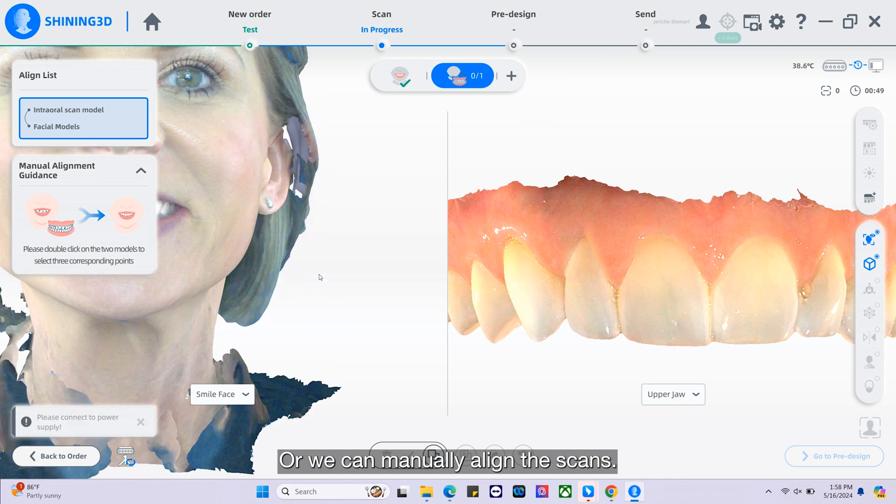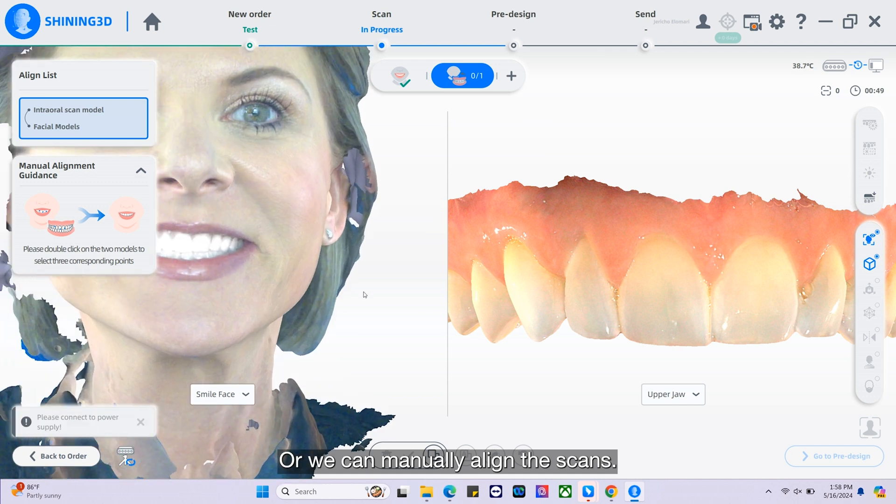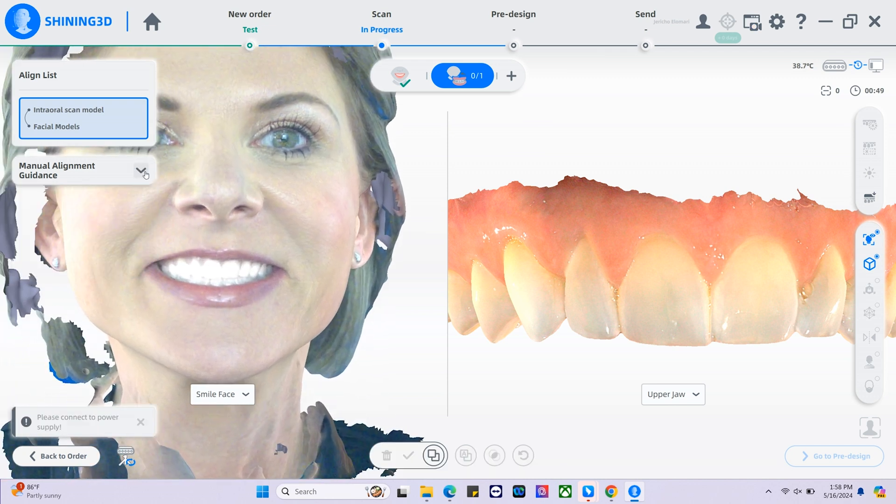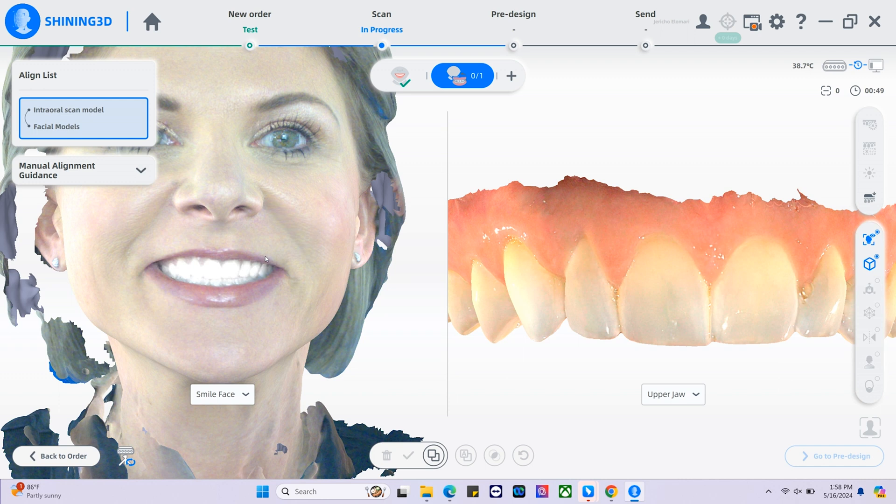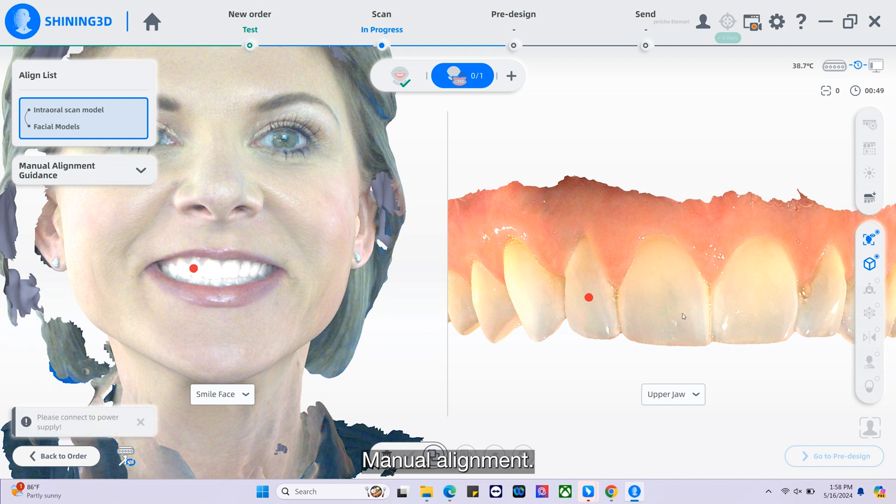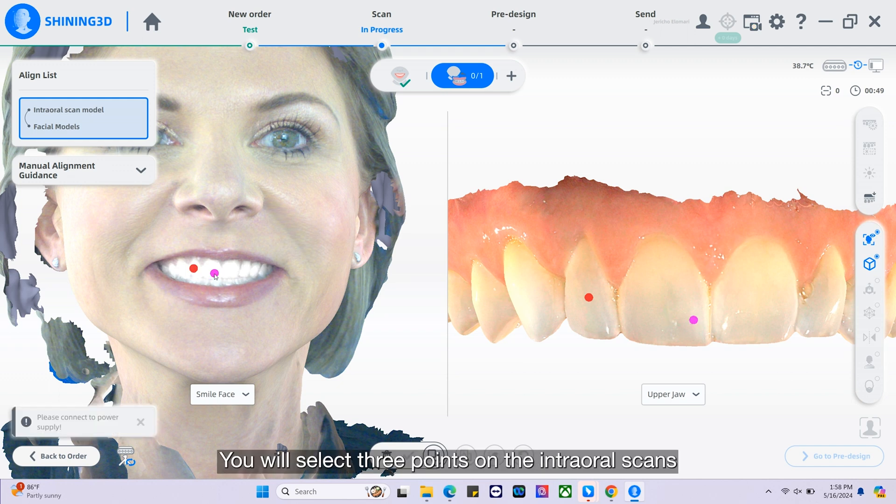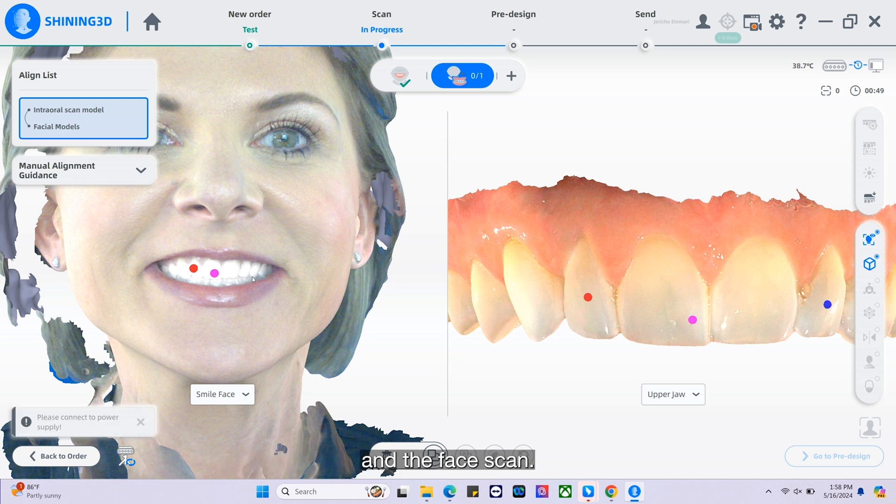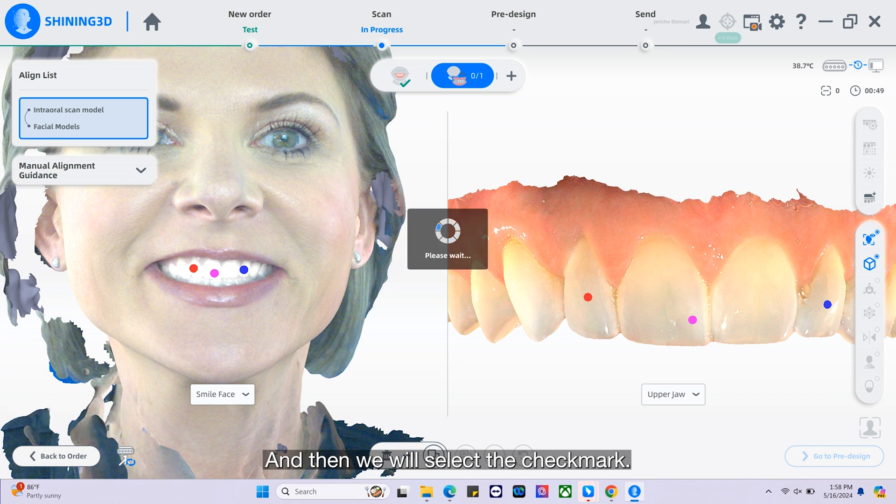Or we can manually align the scans. With manual alignment, you will select three points on the intraoral scans and the face scan, and then we will select the check mark.